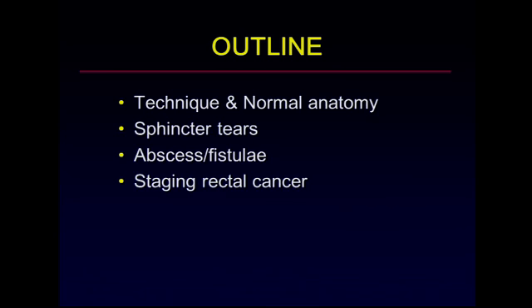At the end of the lecture, we'll briefly talk about the role of ultrasound in evaluating patients with peri-rectal or peri-anal abscesses and fistulae, and then at the very end briefly discuss the potential of ultrasound to stage patients with rectal cancer.